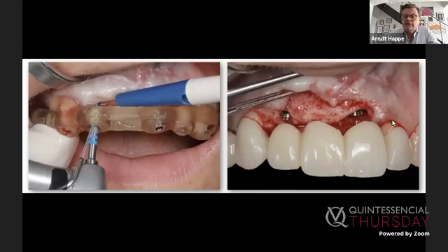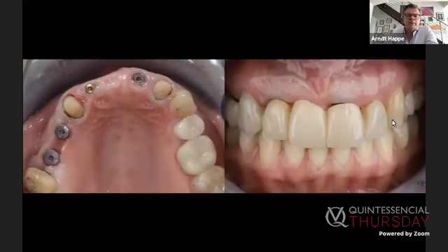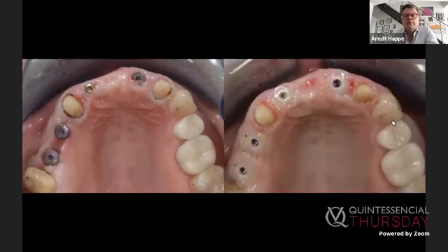And I like this kind of information during my surgery, because bone augmentation is most of the time involved when we do implants in the aesthetic zone, and we need a reference for this. So the X-ray after the surgery, implant positions, the temporary in place, and then what we do is fabricate some individual healing abutments to mold soft tissue, just to place them under the temporary.